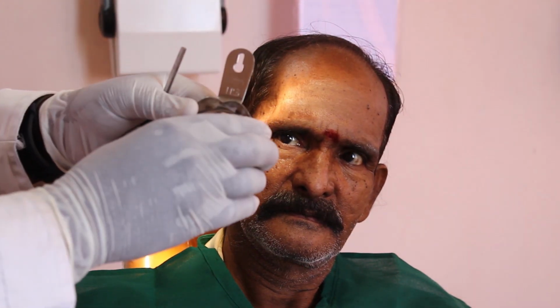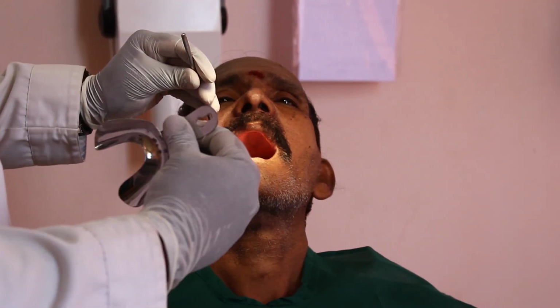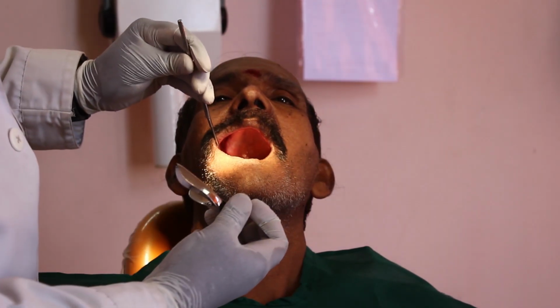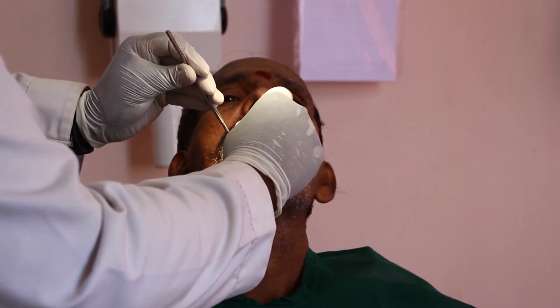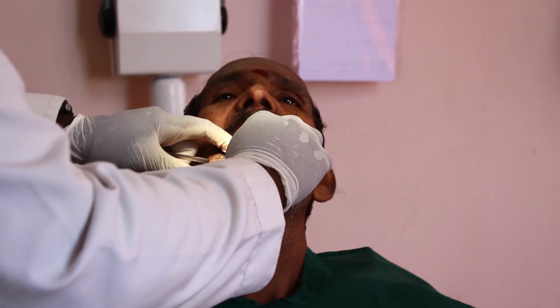Now we are going to see the tray selection for the mandibular arch. Make sure the patient is seated upright, and the operator has to stand in front. In case of a left-handed operator, the operator has to stand on the opposite side. And you have to reflect the cheek muscles on the right side, and insert the tray by rotating it, and then center the tray onto the alveolar ridge.